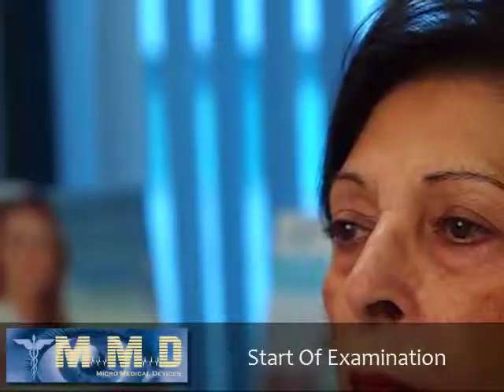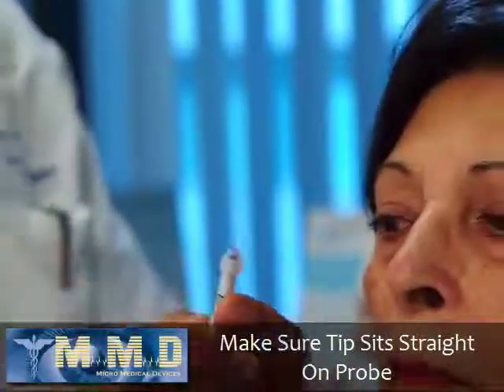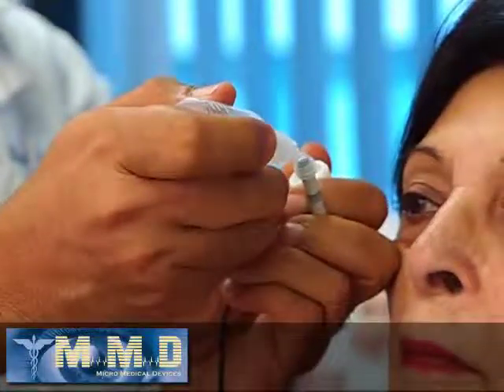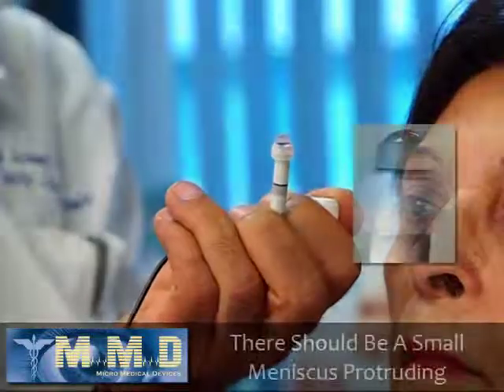Now we're ready to start the examination. So first, what I like to do is fill the EZ Immersion Tip with BSS, and to do that, I just tilt the EZ Immersion Tip and place just enough fluid to fill the chamber and a little meniscus of water on top.